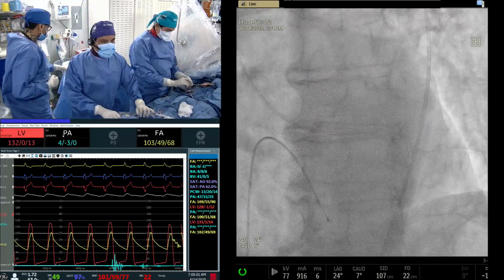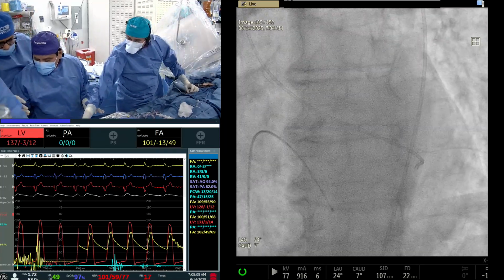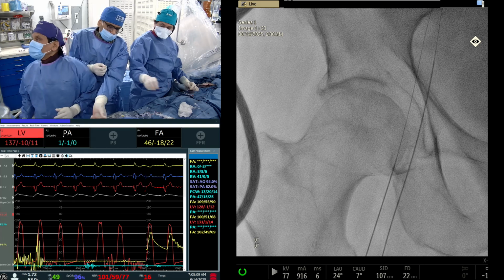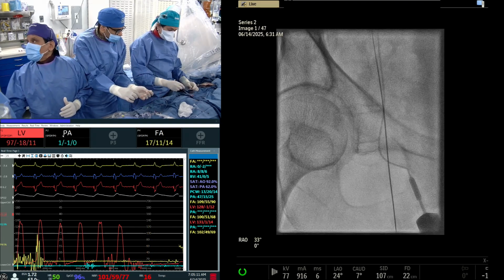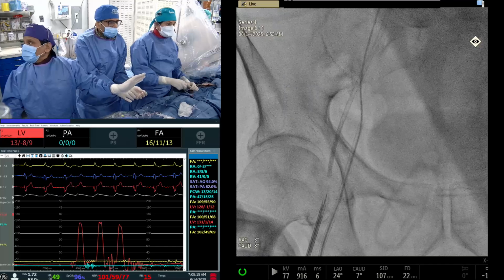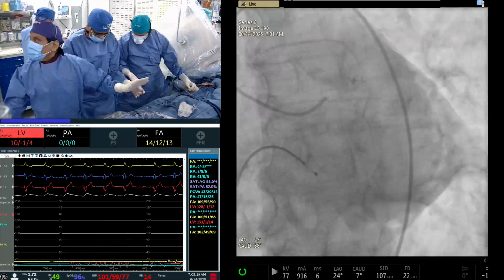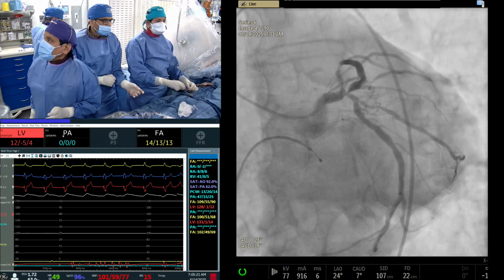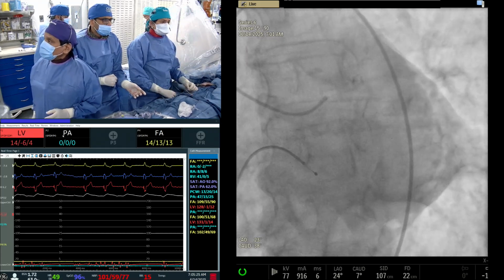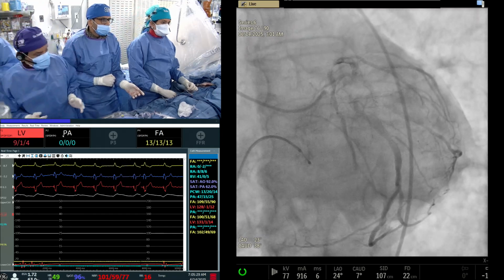It's a 45 plus gradient. So let's go to the angio, particularly, it's a 10 French sheath. We did the left system. Okay, here. This is the left main disease. Look at that. Subtotal LAD, multiple lesions, kind of a left dominant system with a lot of disease, which you can see here. We'll come to that.